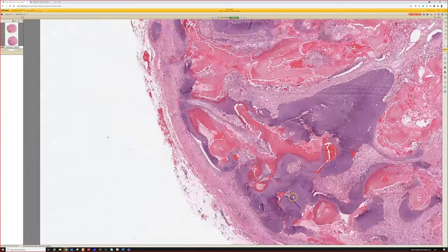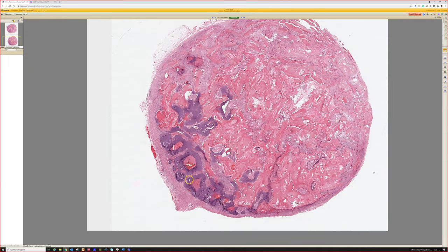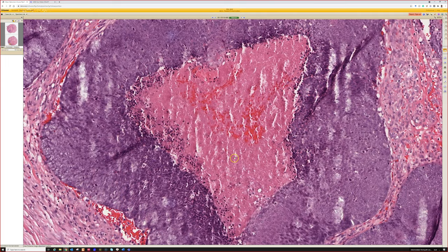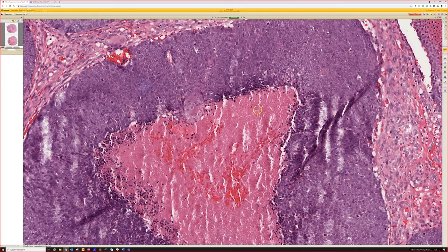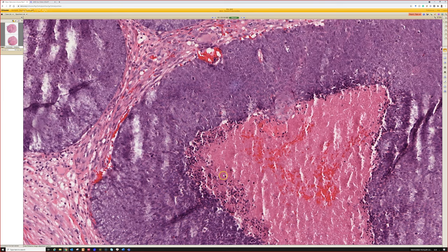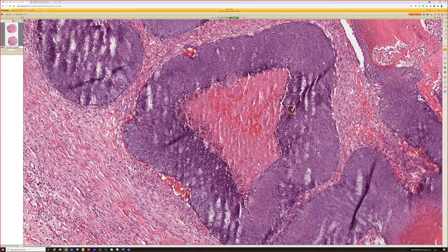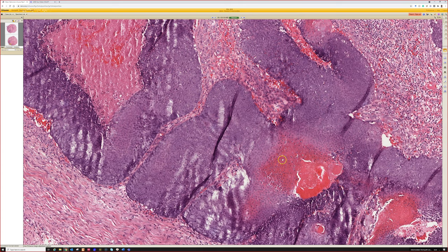And then this one had also, I think, a nice little focus of, yeah, the blue basaloid cells can actually have individual single cell necrosis sometimes. Don't be worried. To me, I think that's normal to see. And I've seen times on a needle biopsy on cytology where these blue cells, a lot of mitoses and necrosis gets people concerned for malignancy. But in the setting of pilomatrichoma, in my opinion and experience, this is a normal, common, benign finding.